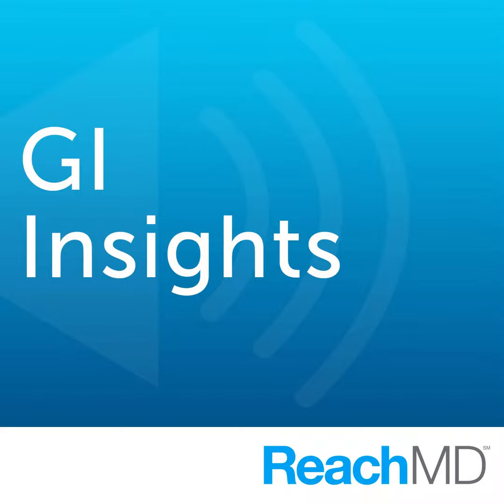I take it this tool, this microscopic imaging, would be very important in those disease states. Yes, it really would be. Right now, we as gastroenterologists are essentially limited to doing random biopsy to try to find these small foci of dysplasia, which is really comparable to trying to find a needle in a haystack. If we had techniques of imaging to help guide us, we would be able to find the problematic areas much more easily.